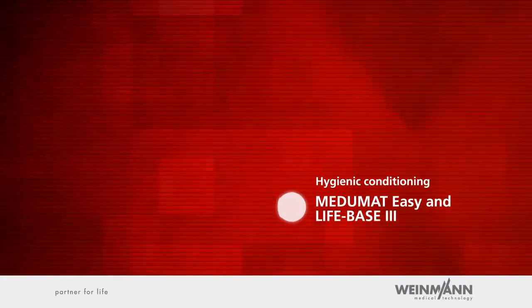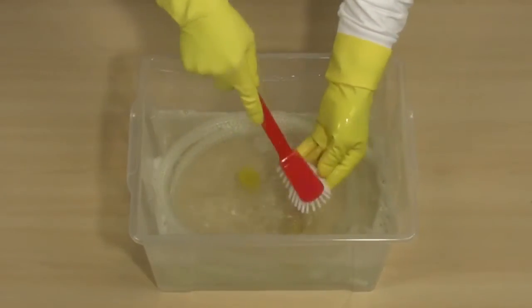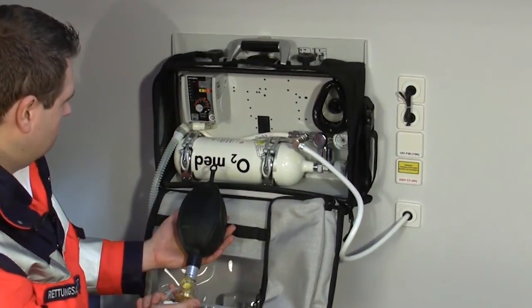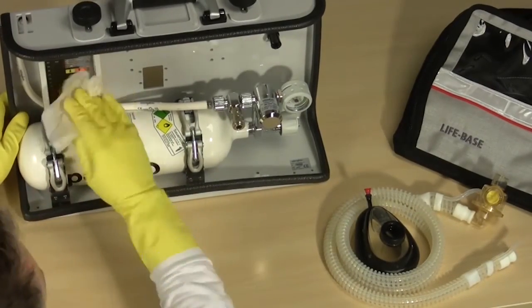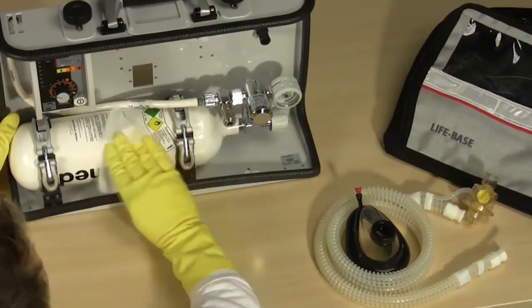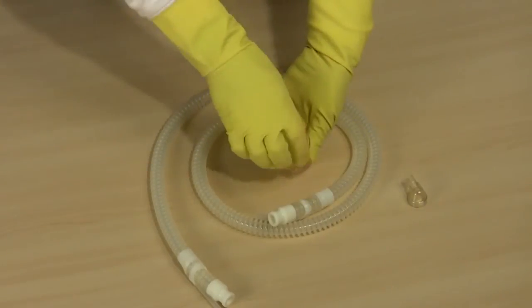MEDUMAT Easy and all utilised accessories must be hygienically conditioned after every use to prevent the transmission of bacteria and viruses to future patients. Make a functional check after every hygienic conditioning to ensure that MEDUMAT Easy has been correctly reassembled and is ready for use. Keep MEDUMAT Easy, the portable system LifeBase 3, the pressure reducer and oxygen cylinder clean with a simple wipe disinfectant. If required, you can clean the LifeBase 3 protective bag in the washing machine at a maximum temperature of 30 degrees centigrade. Pay close attention to the patient hose system as it has the most direct contact with the patient.